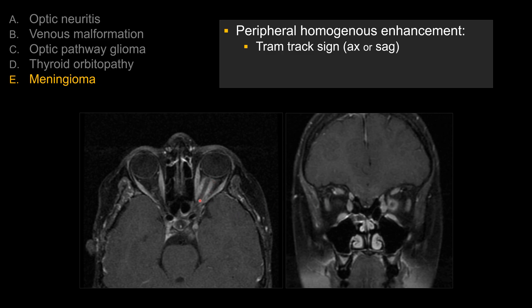Here you can clearly see a lesion that's outside of the optic nerve. On the axial view, the enhancement is parallel, like a track — the so-called tram track sign. On the coronal view, the enhancement is circumferentially surrounding the optic nerve. The non-enhancing central portion is the nerve itself, which looks like a donut — the donut sign.